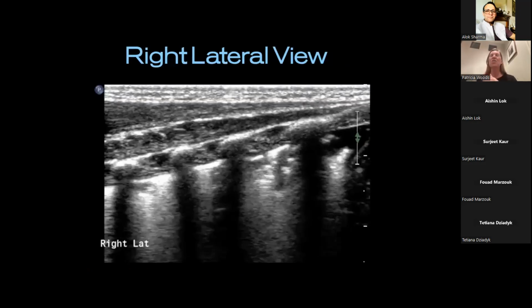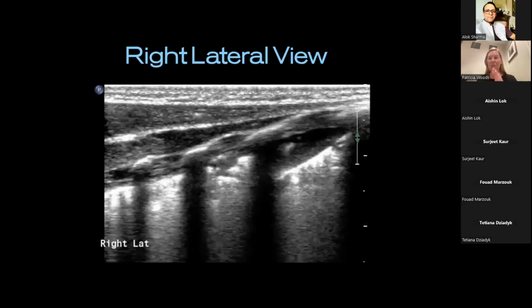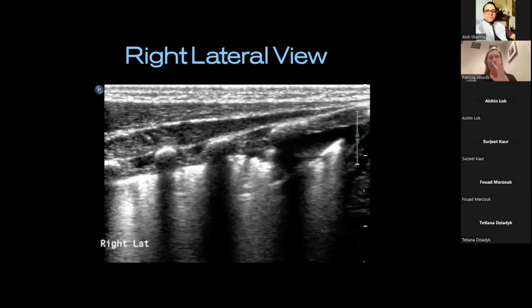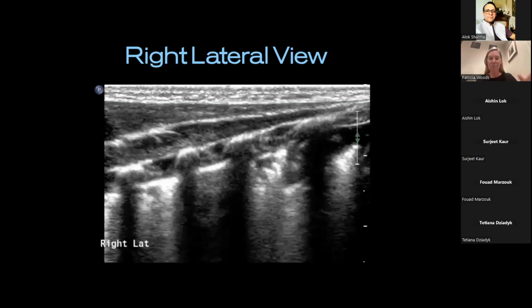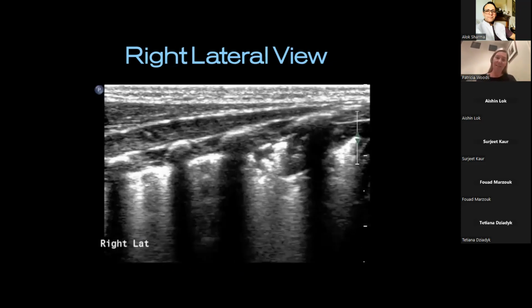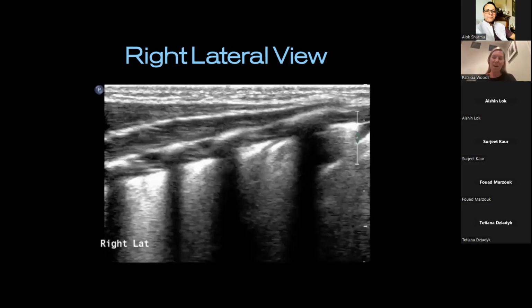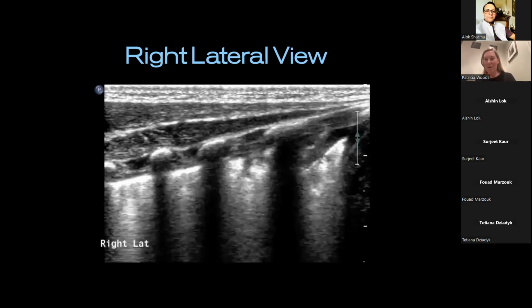And one of the things to do is just break that cycle right there. What I've done in that patient is gone for the money shot. Where am I most likely to detect pneumothoraces in the least dependent area? If you stop for a moment, come down laterally, okay? Just come down to another area. And if you put your probe on and you get this picture, you can see there, this is a lateral one. You've got your costophrenic angle coming in, little diaphragm, maybe a tiny bit of fluid. That's what it should look like everywhere.